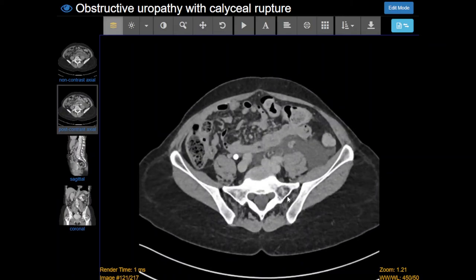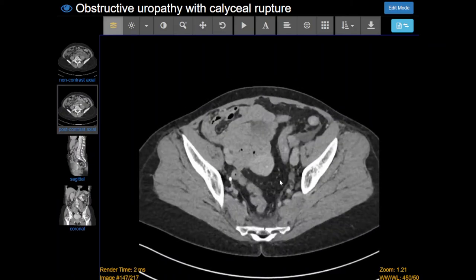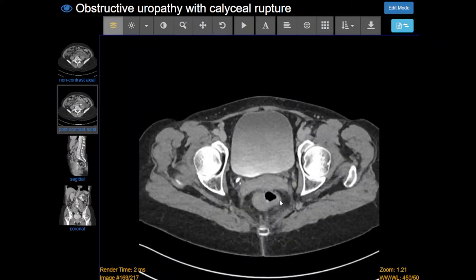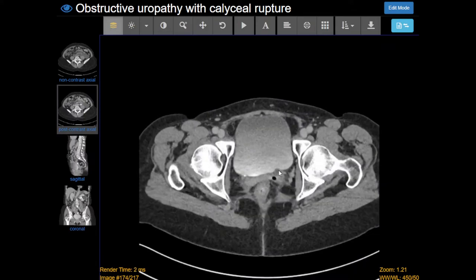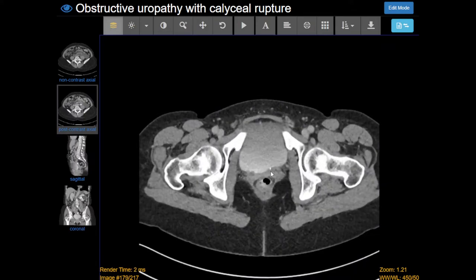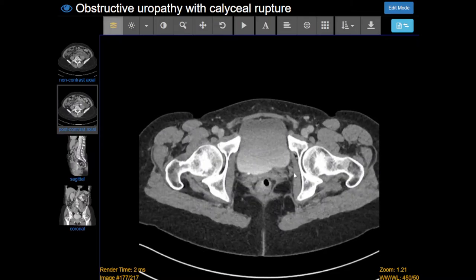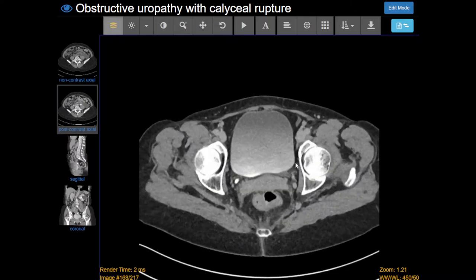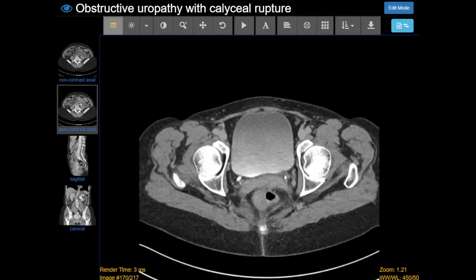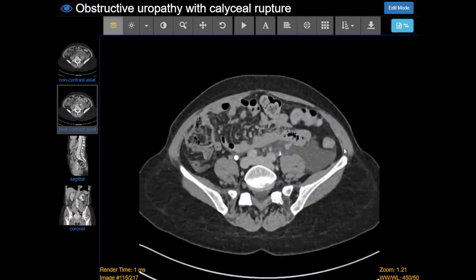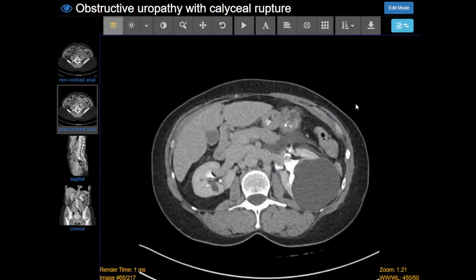You can follow the ureter down to see if we were right about that kidney stone. All the way down — here's that ureter, and there's that kidney stone. It is indeed lodged there at the ureterovesical junction, and that is our culprit. That was causing backup and increased pressure. You can see the ureter is still a little bit dilated on the left side, and ultimately rupture of the collecting system.